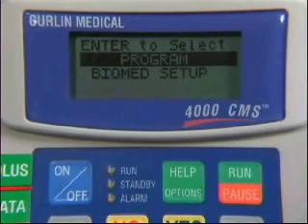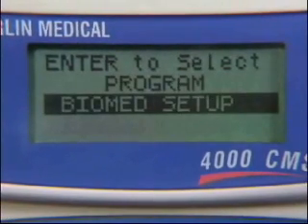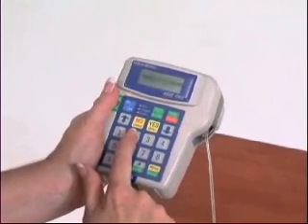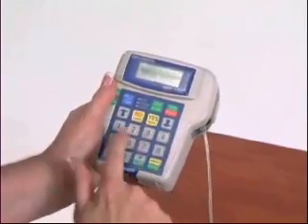Only the biomedical staff will use the Biomed line. There will be a highlighted area or black bar on the pump display screen. The up and down arrow keys may be used to move the highlighted bar. The Yes Enter button must be pressed to confirm or accept what is highlighted, and the No Change button must be pressed to change what is highlighted. The rest of the keypad is for numeric entry.